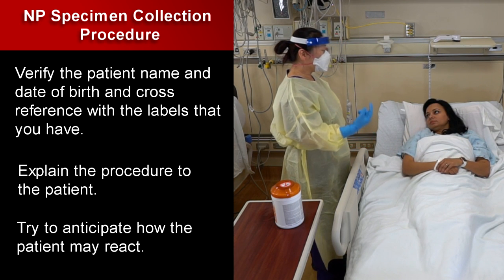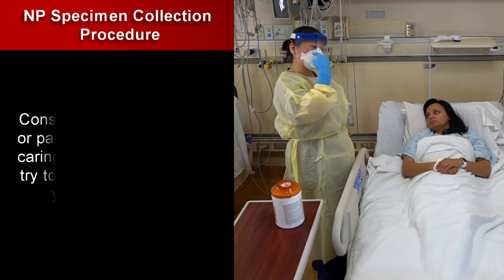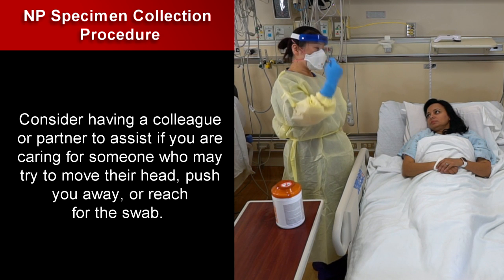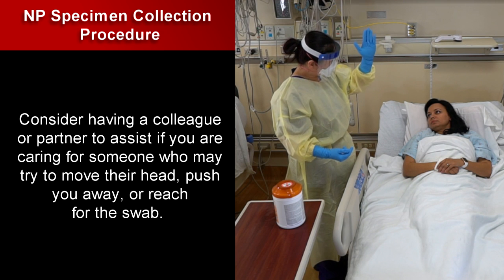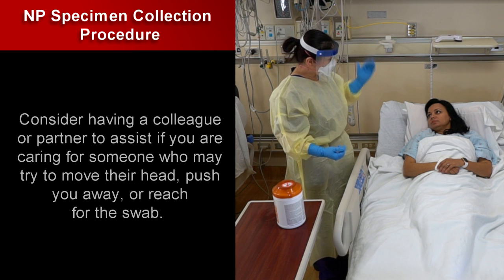Try to anticipate how the patient may react. Consider having a colleague or partner to assist if you are caring for someone who may try to move their head, push you away, or reach for the swab, such as a pediatric patient.